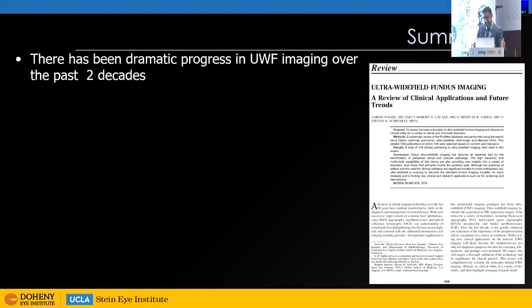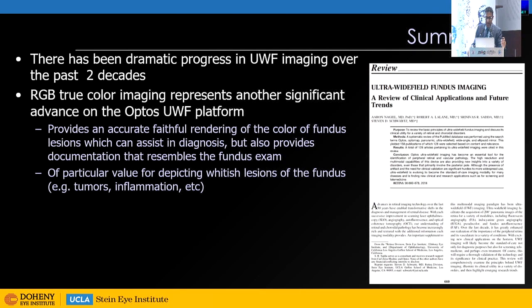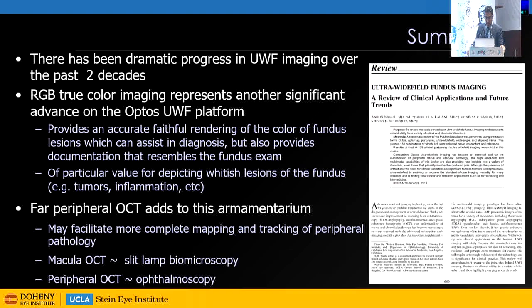So to summarize, I think we're pretty fortunate. There's been a lot of progress in ultra-wide-field imaging over the past 2 decades. I do think that the addition of the blue laser is not a small deal. I think it's a big deal because it does provide us, as I showed you with many case examples, an accurate and faithful rendering of the color of the fundus. So it really documents what we actually saw when we saw the patient's eye, and I showed you how it's helpful in whitish lesions in particular. So you can imagine in the setting of certain tumors and inflammatory diseases, that's going to be especially valuable.